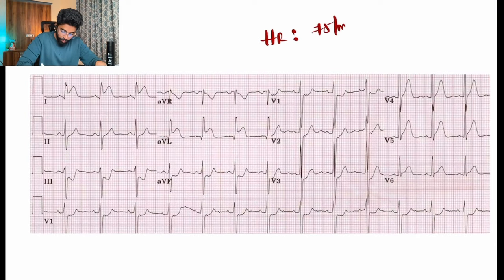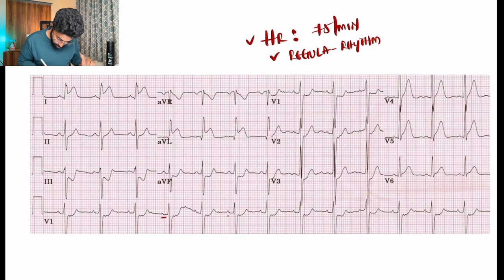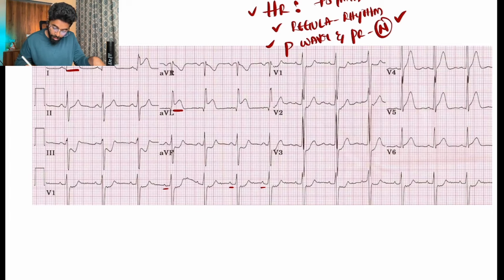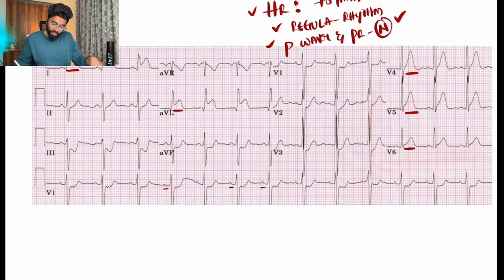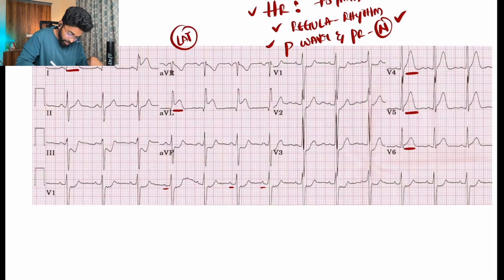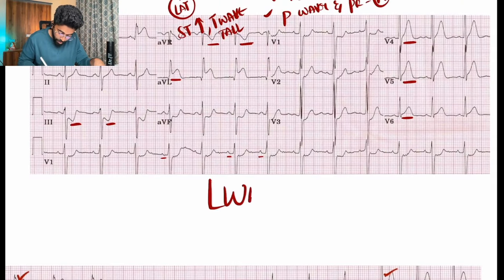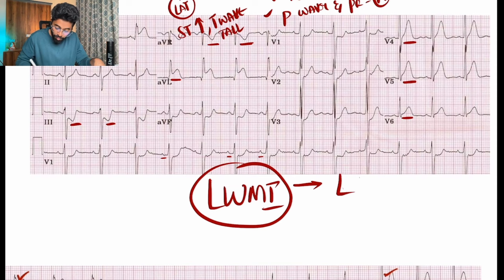For the next ECG: heart rate around 75, regular rhythm, P waves and PR interval look almost normal. There is ST elevation and T wave changes in AVL and lead 1. Since leads 1 and AVL are lateral leads, we should also see changes in V5 and V6 — and yes, changes are present in V4, V5, and V6 as well. Therefore this is lateral wall MI, with the blocked artery being the LCX.